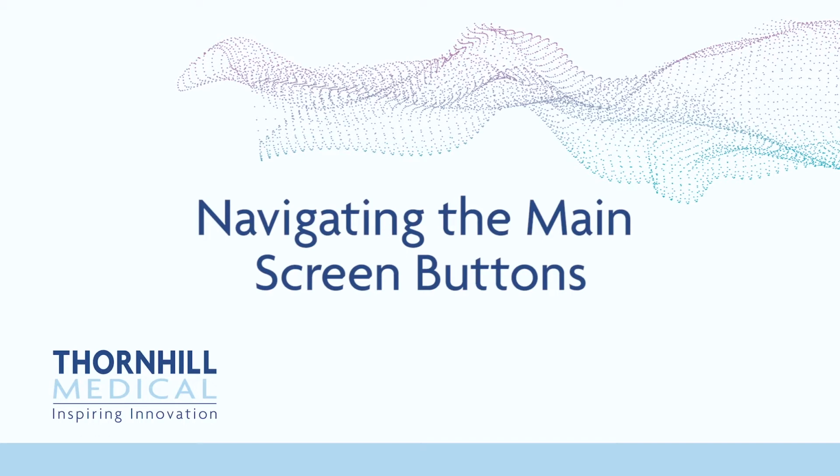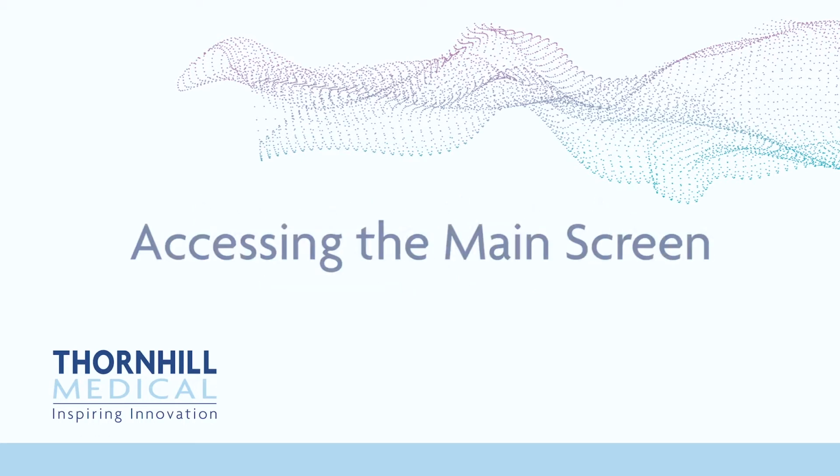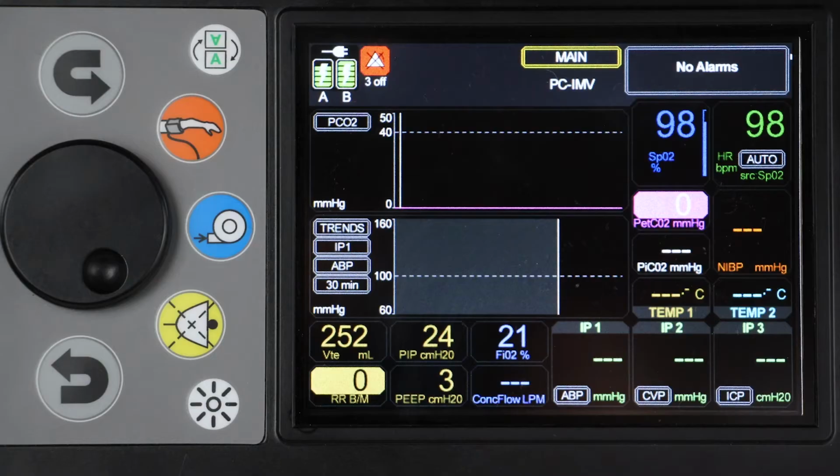Navigating the main screen buttons. Accessing the main screen. As the primary screen of MOVES SLC, the system will always return to this screen after a period of inactivity. The most recent software release allows for single button press changes between the setup screen and the main screen.